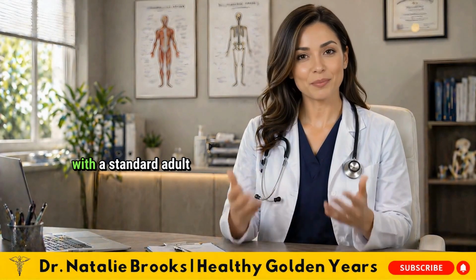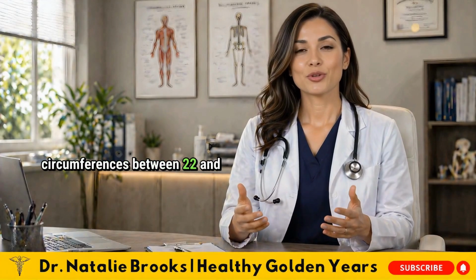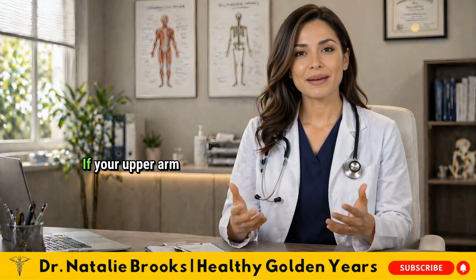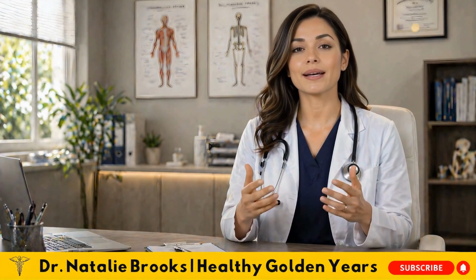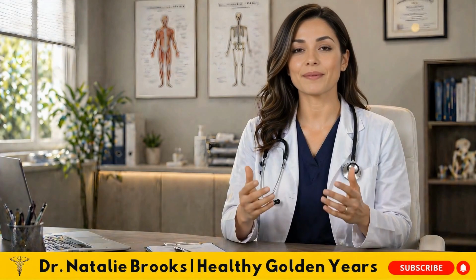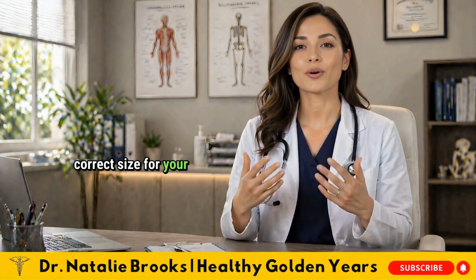Most home monitors come with a standard adult cuff that fits arm circumferences between 22 and 32 centimeters. If your upper arm is larger or significantly smaller than this range, you need a different cuff size. Ask your pharmacist or doctor to help you measure and confirm the correct size for your arm.